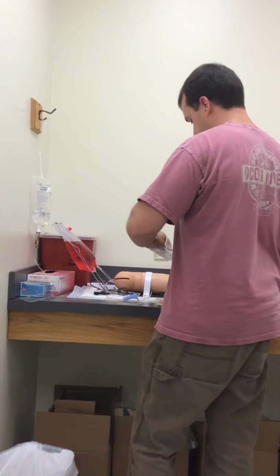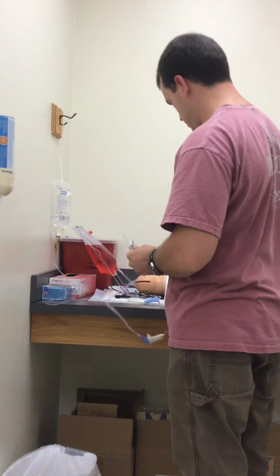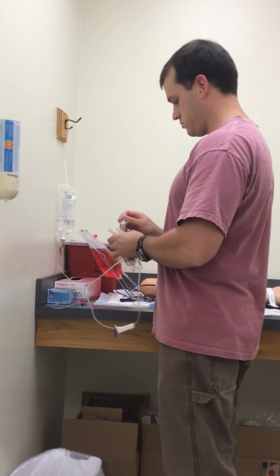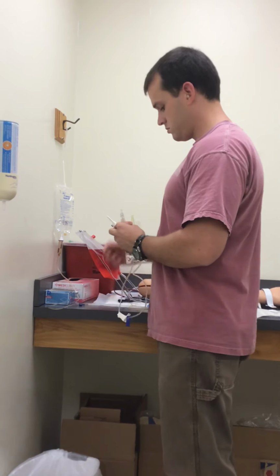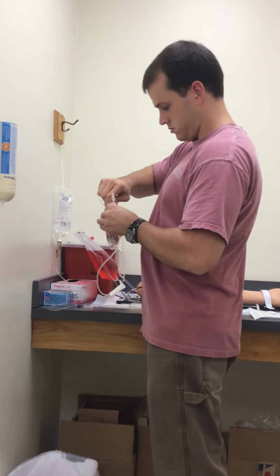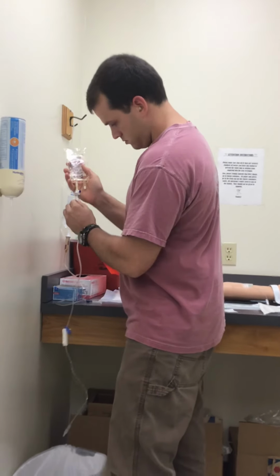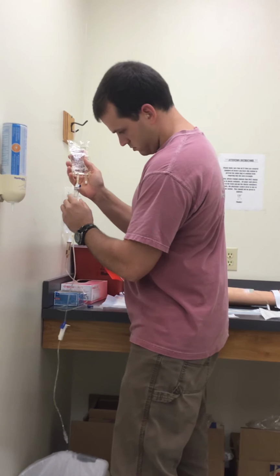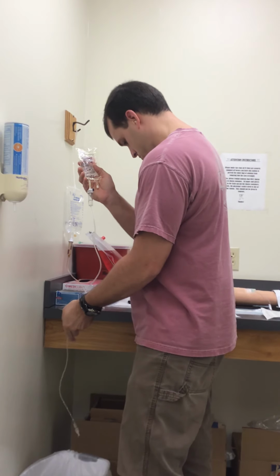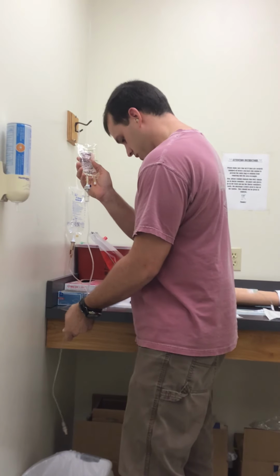I personally prefer to prime the tubing in the patient's room. Get all the bubbles out of the line.